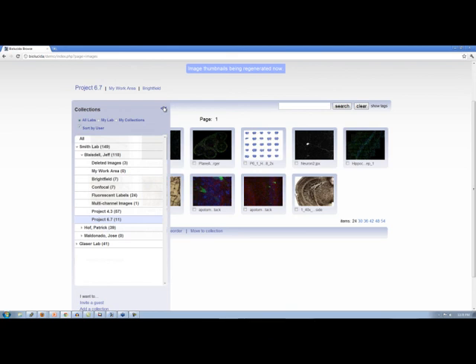Right, and what we want to avoid here is if you have a terabyte-sized file, making 5 copies of this on the server. Exactly. So if you were to make a copy, you're actually not copying the underlying physical image data. You're just copying references to that data, and each of those can have independent information that we had seen with descriptions and notes and things like that. Okay.